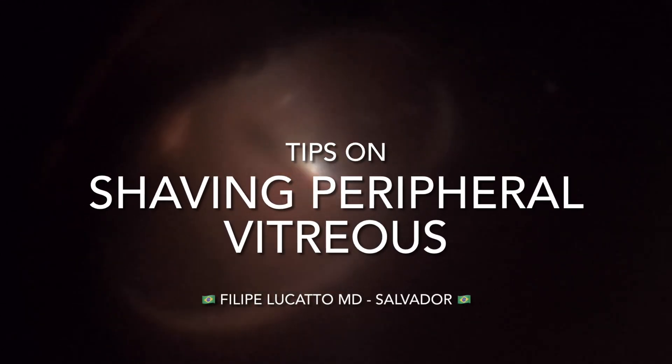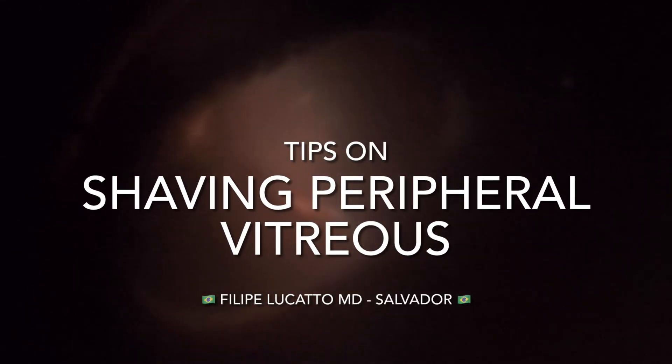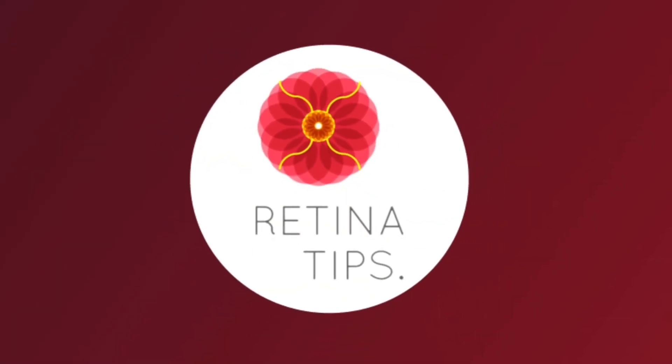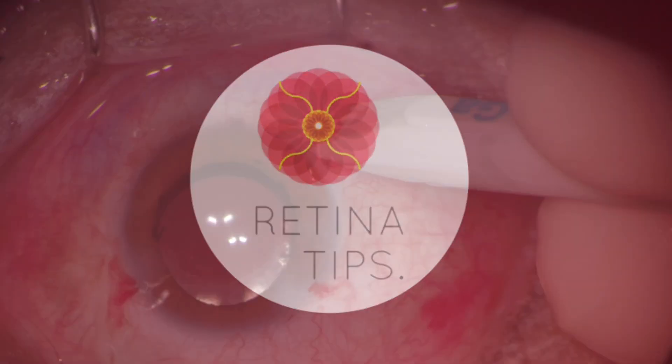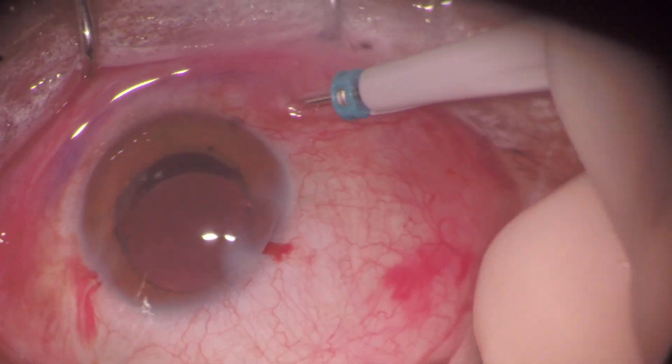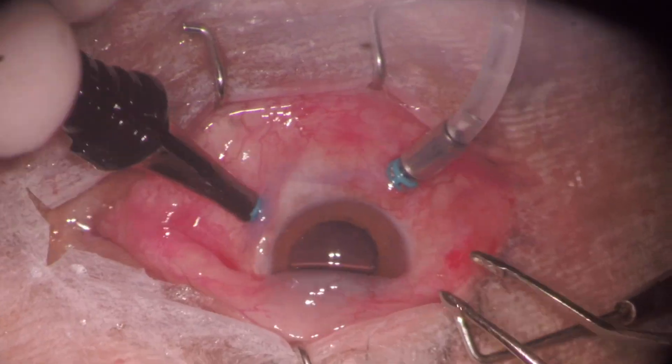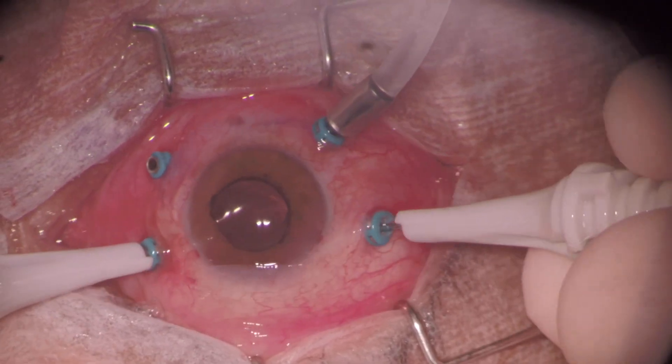In this video, we discuss a tip to improve visualization for shaving peripheral vitreous with sclerodepression. New technologies like a wide-angle viewing system, high-speed vitreous cutter, small incision trocar systems, and chandelier light enable surgeons to perform a thorough vitrectomy, which is crucial for treatment of many vitreoretinal pathologies.